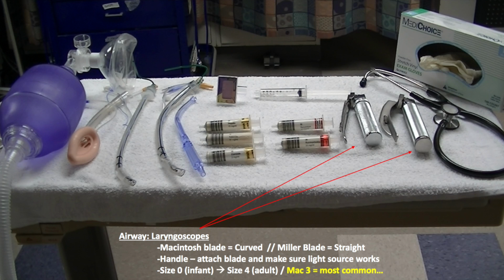Laryngoscopes come in two varieties, the Macintosh blade and the Miller blade. The Mac is the curved blade, and the Miller is a straight blade. If you get confused, just remember, Miller has two L's in its name, which are straight letters, while Macintosh has a C in its name, which is a curved letter.